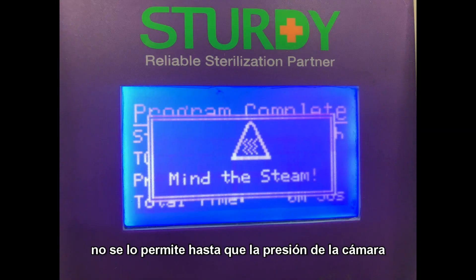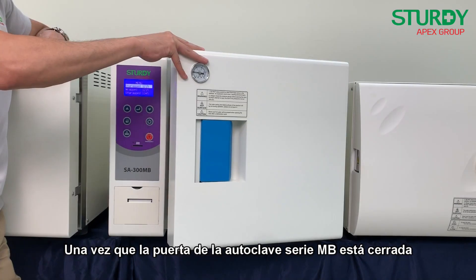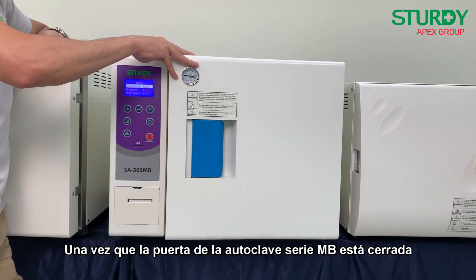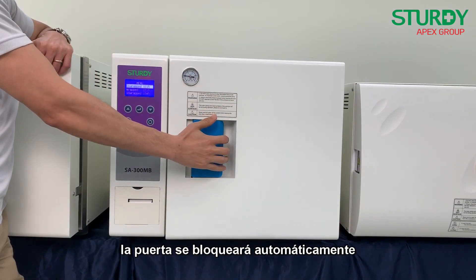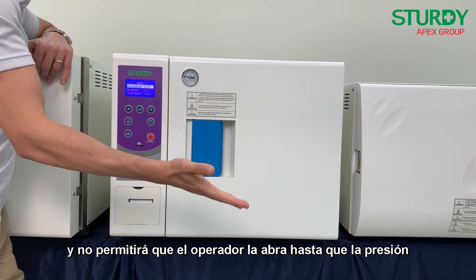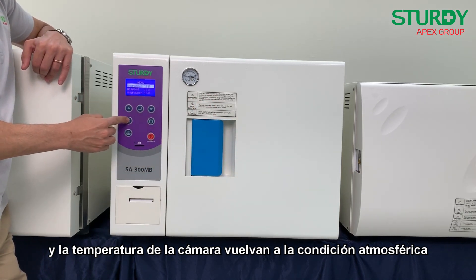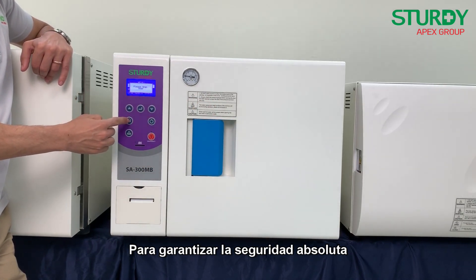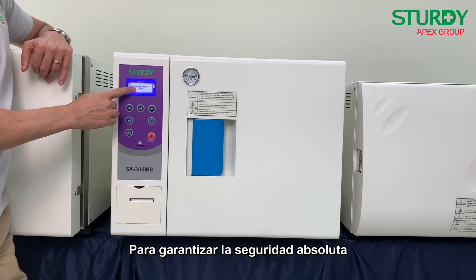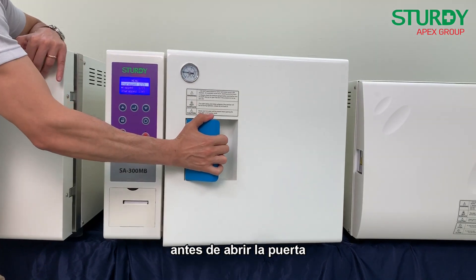Since safety is an uncompromising factor, besides overheat and pressure overload protection, another genius design is its protective mechanism. When an operator intends to open the door during operation, the door cannot be opened until the chamber pressure drops to atmospheric pressure. Once the door of the MB series autoclave is closed, it automatically locks and does not allow the operator to open it before chamber pressure and temperature return to atmospheric condition. The operator must manually press the unlock button before the door can be opened.